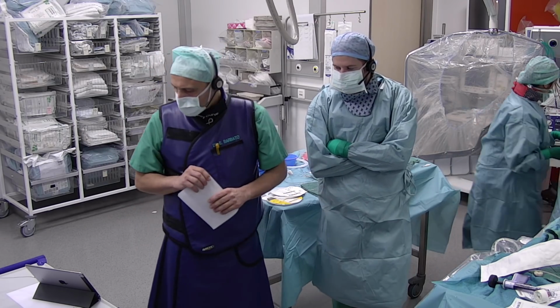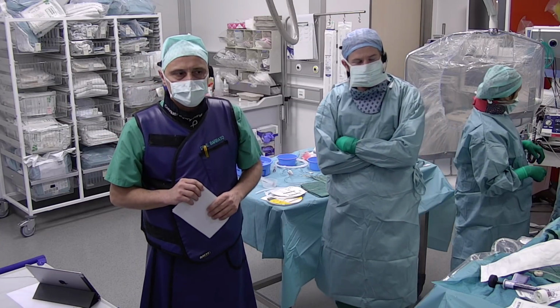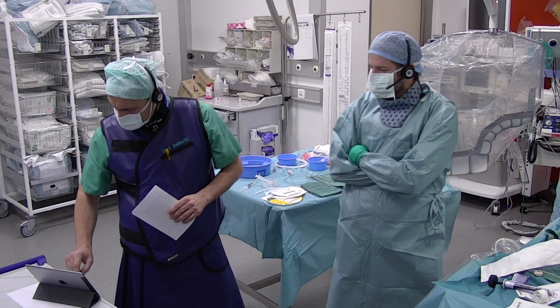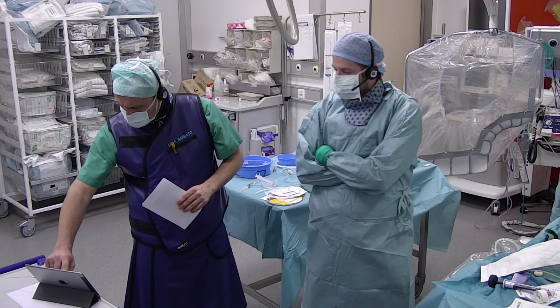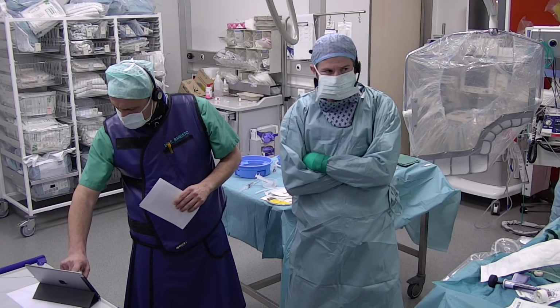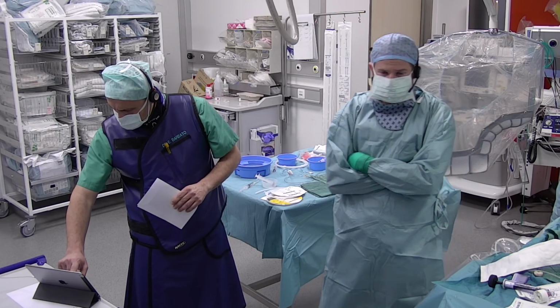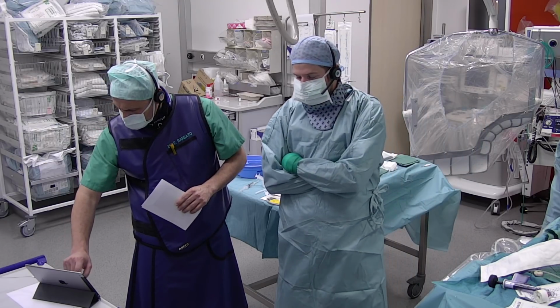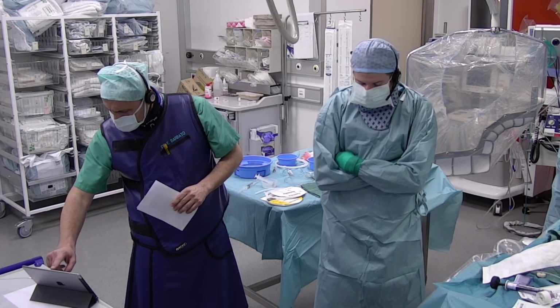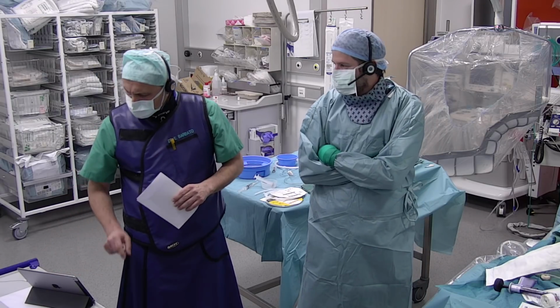Why not use a 4 mm stent from the beginning instead of a 3.5 post-dilated to 4.5? Well, it's a very important question, and it's important to clarify that in case of bifurcations, you choose your stent according to the distal main branch size. Here the LAD was clearly 3.5, so a 4 mm stent would be a bad choice, because it oversizes the distal main branch and compromises the side branch access. So the right choice is according to the size of the distal main branch, which was clearly 3.5 here.